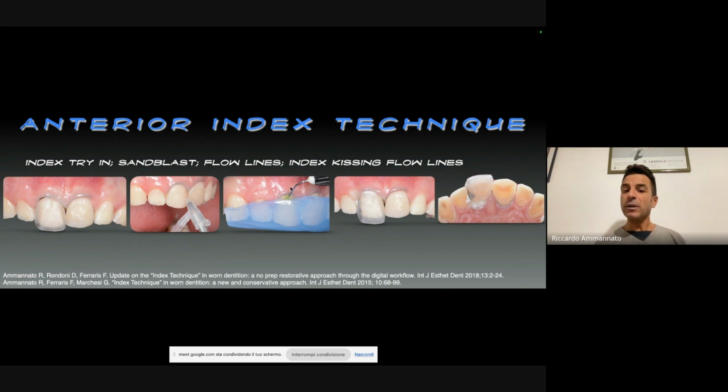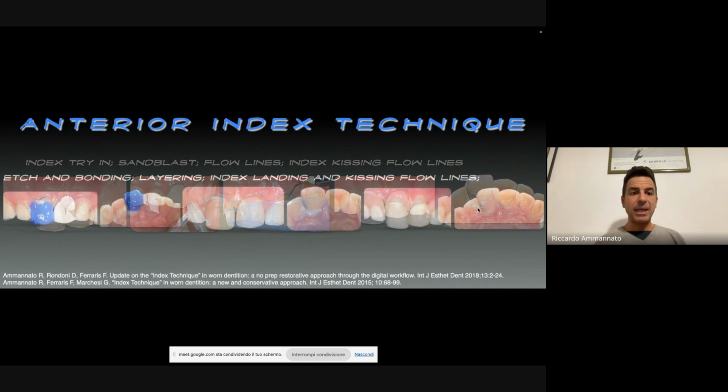The patient wanted to maintain, I didn't mention this, the diastema that he had. So that was his desire. So you will see at the end, that's why here I didn't place any protection, no Teflon, no matrix, because we had the space, there was a diastema, there was a gap. And so we are checking, however, the correct landing of the index, kissing the stabilizers, okay?